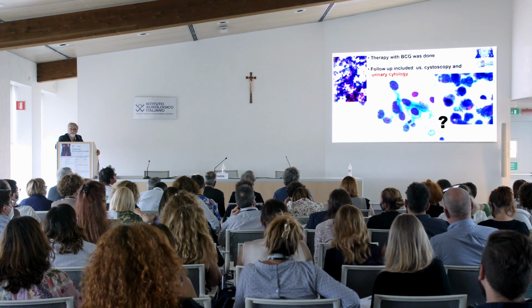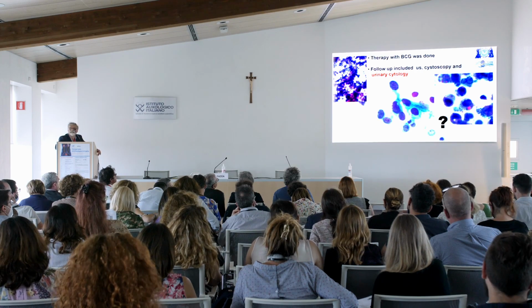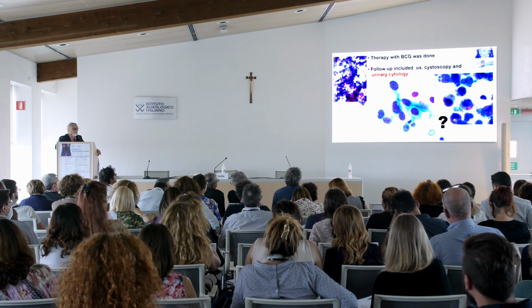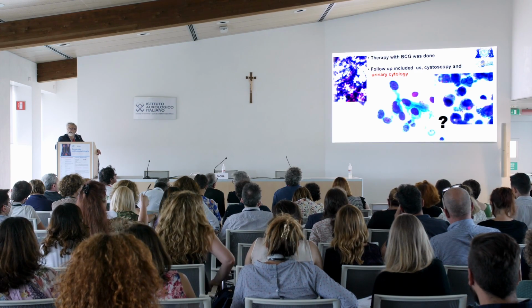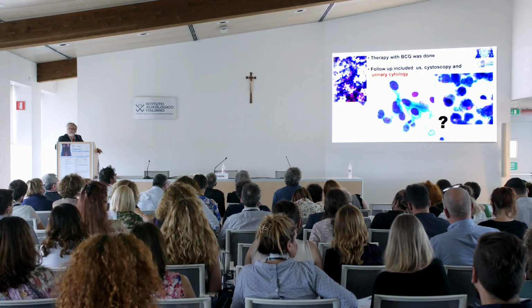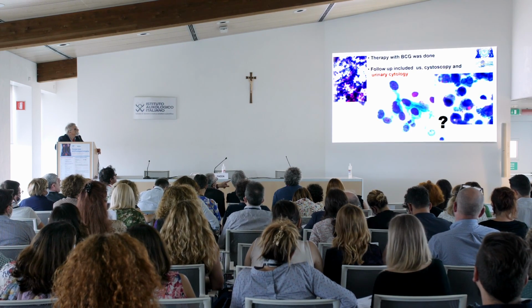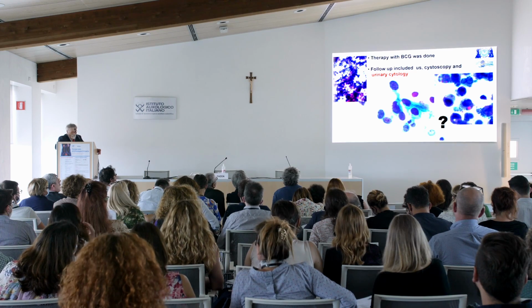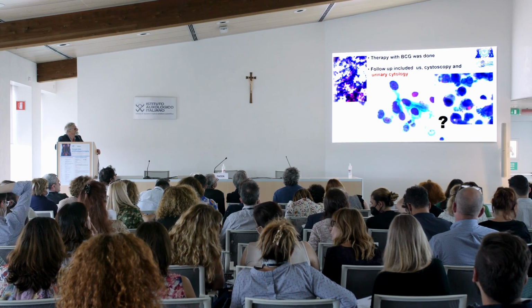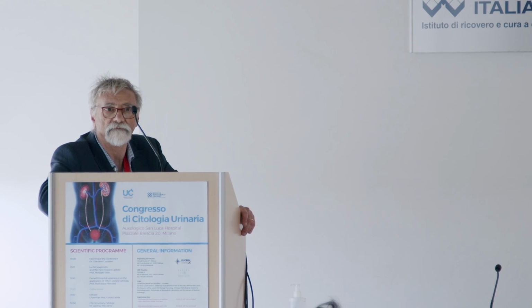The audience, not only the professor, because we want to play a game with you. Nobody? Positive, negative, undetermined? So, the challenge is this, clear. This, in my opinion, is very easy.